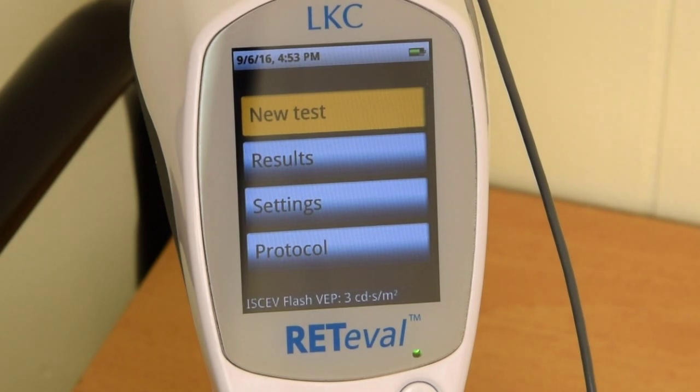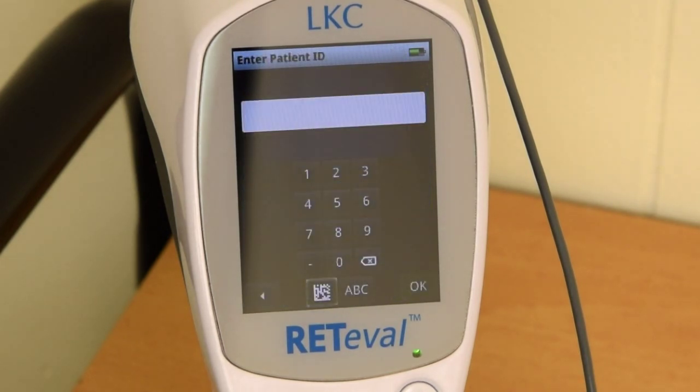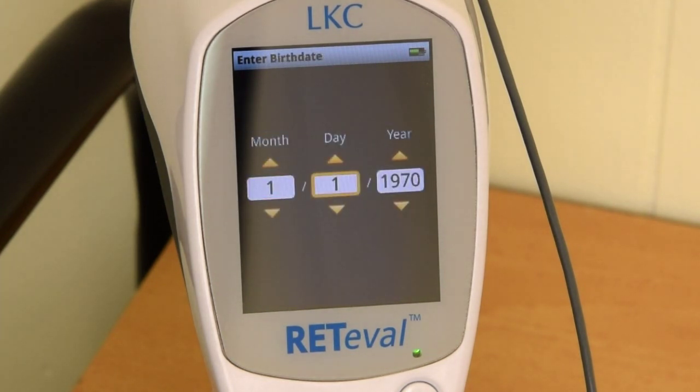On the main menu, select new tests. The first window will prompt you to enter patient information. If you have the data barcode entry application software, you can use this to scan patient information. If not, you can use the joystick to enter patient ID and then the birth date. Once you enter this information, the device will move forward to a confirmation screen for both the protocol and the patient information.